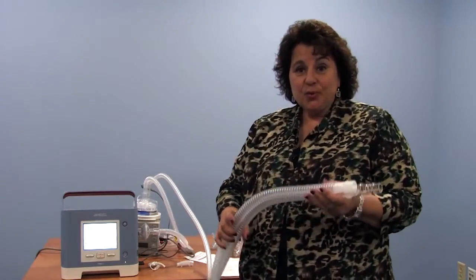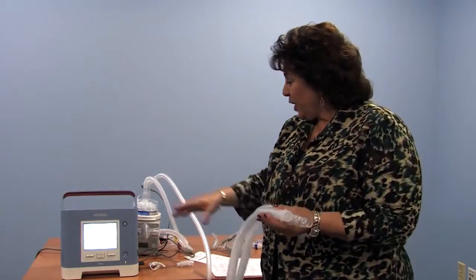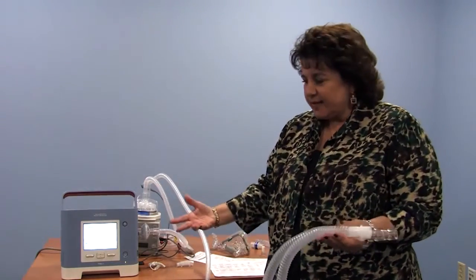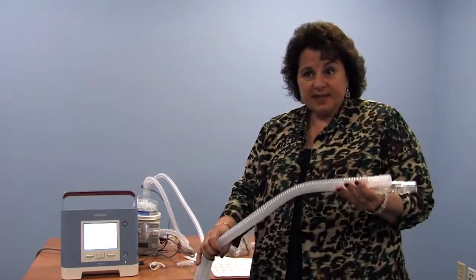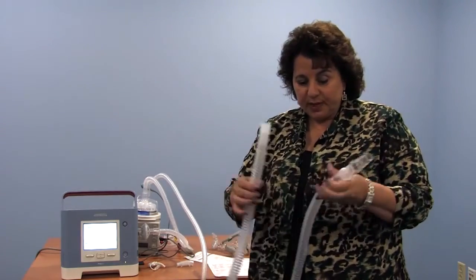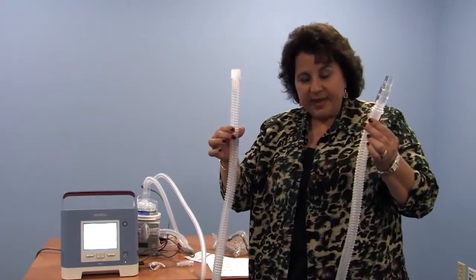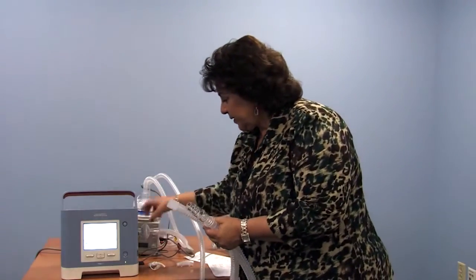I'd like to show you how you travel with this machine out of the home. We're not going to travel with the humidifier, as that is bulky, has water in it, etc., for obvious reasons. So the Trilogy company does make several different circuits. This would be an example of the passive circuit without humidification. For this circuit, I merely am going to disconnect the humidifier.